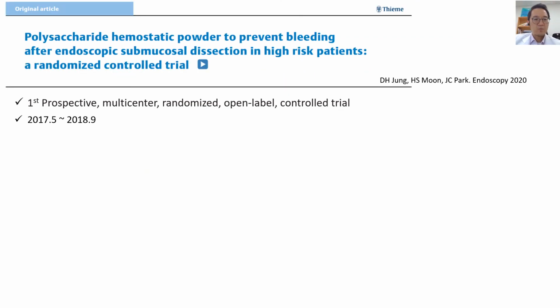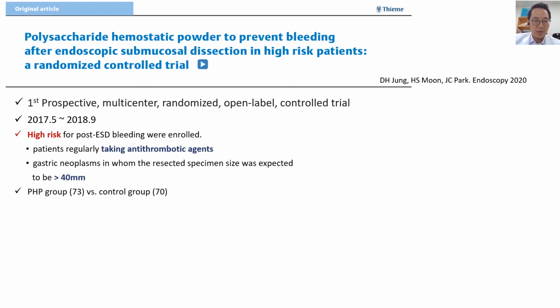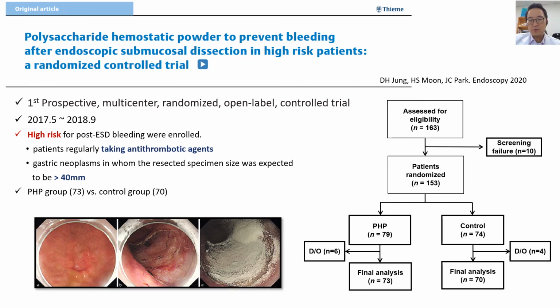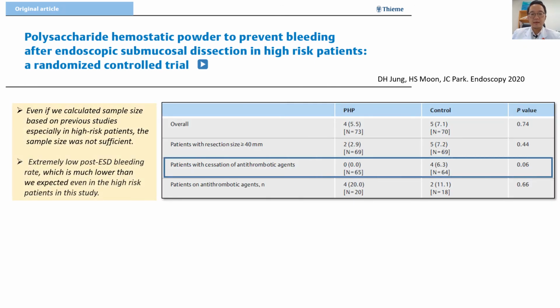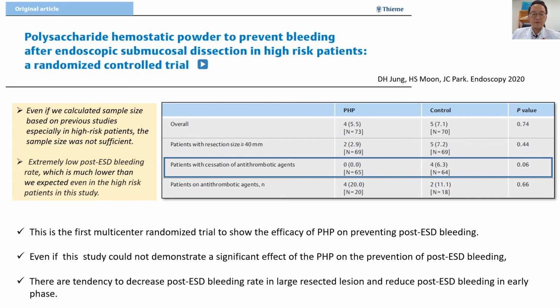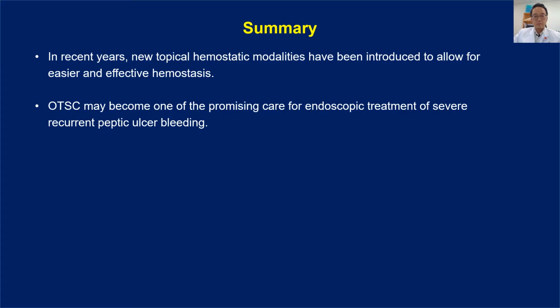So we designed a prospective multicenter randomized controlled trial to evaluate hemostatic powder for preventing post-ESD bleeding in high-risk patients, and this study was published last year in Endoscopy. And this study also shows the possibility that the powder can prevent post-ESD bleeding in large resection sites.